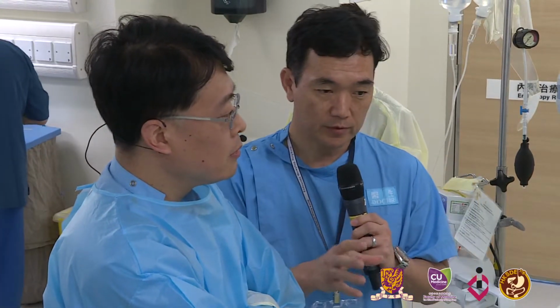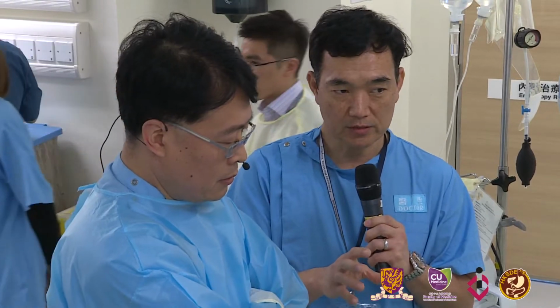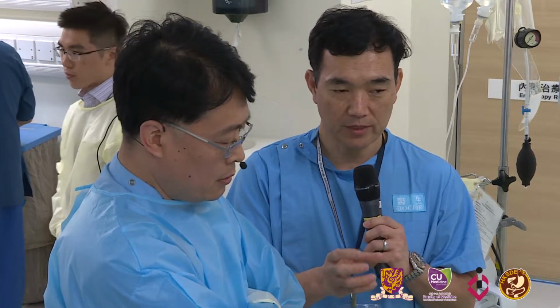You have to get the tissue into the cap, and sometimes the lesion is too big to come into the cap. So if the tumor is more than 2 centimeters, it gets a little bit iffy whether you can really get a negative margin. So you have to choose your battle. But that's one consideration. How big was this tumor? The tumor is 2.6 centimeters.